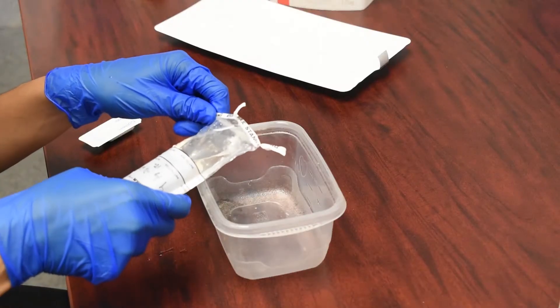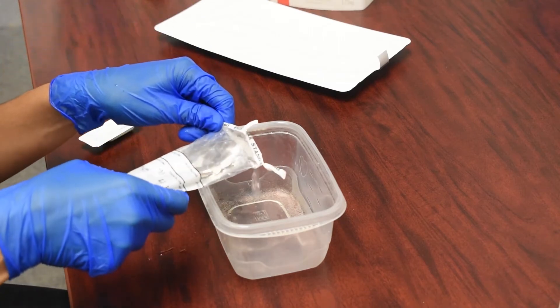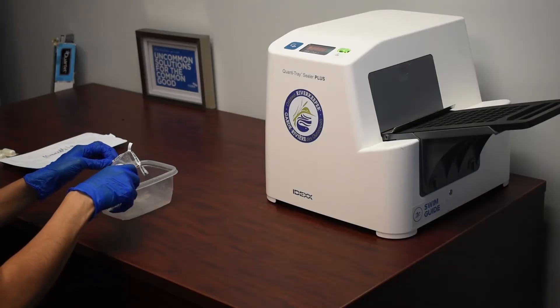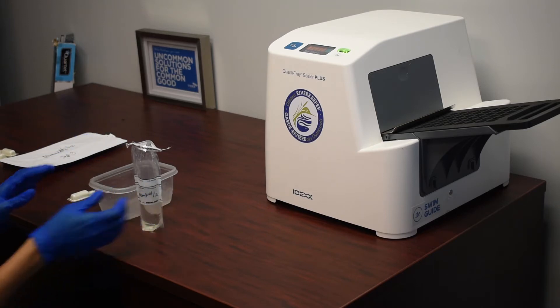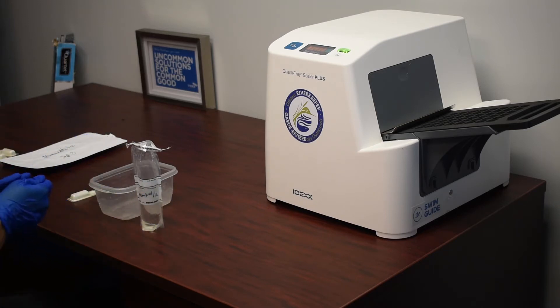We'll pour out any excess sample that is in the Whirlpack bag. The Whirlpack bags are marked with a 100 milliliter fill line to help us ensure that we have a 100 milliliter sample.